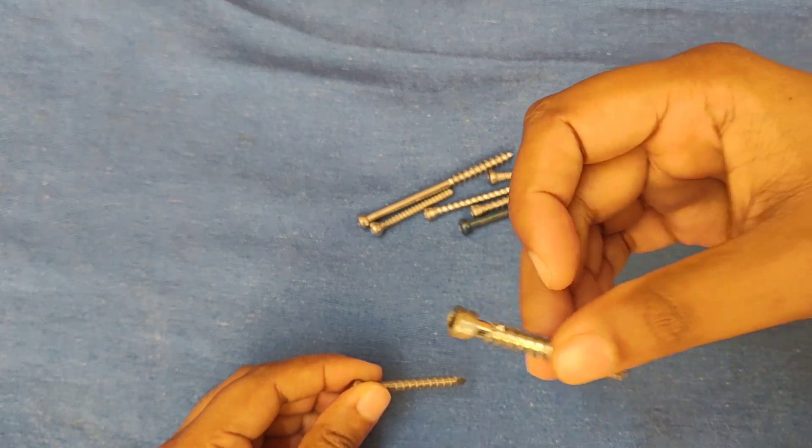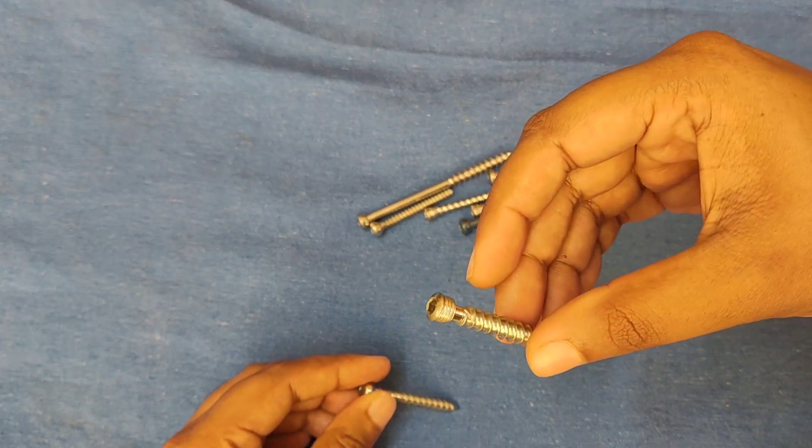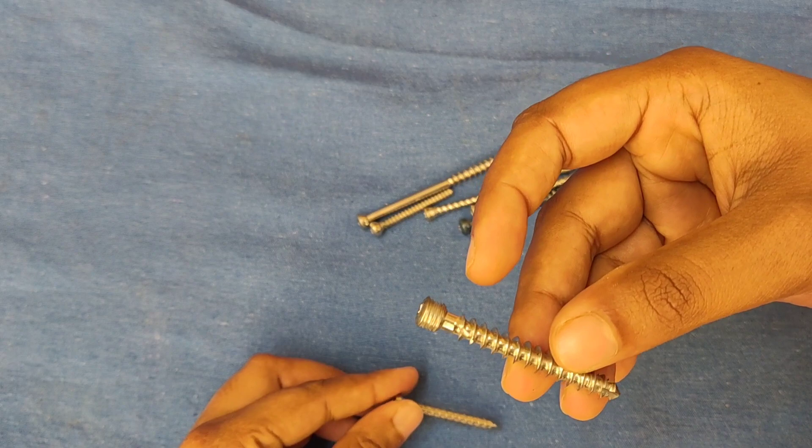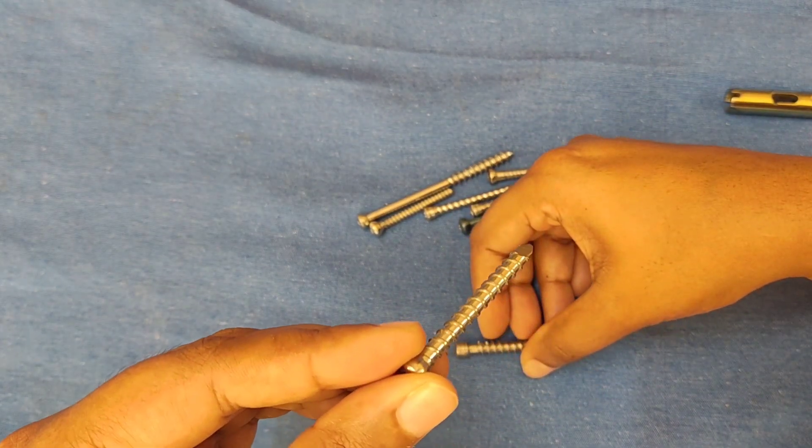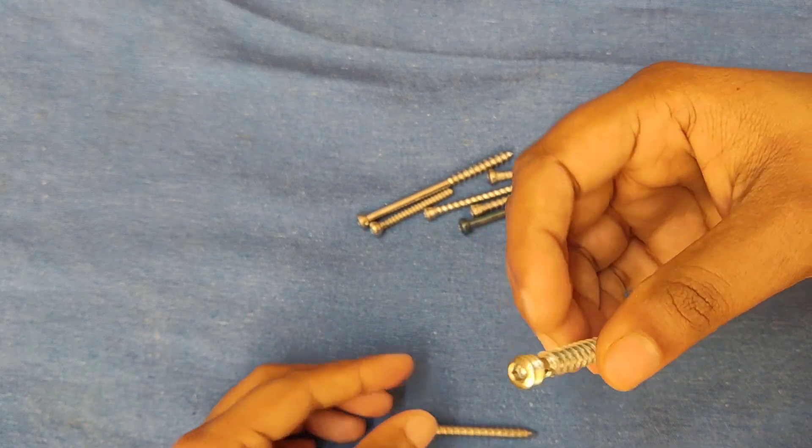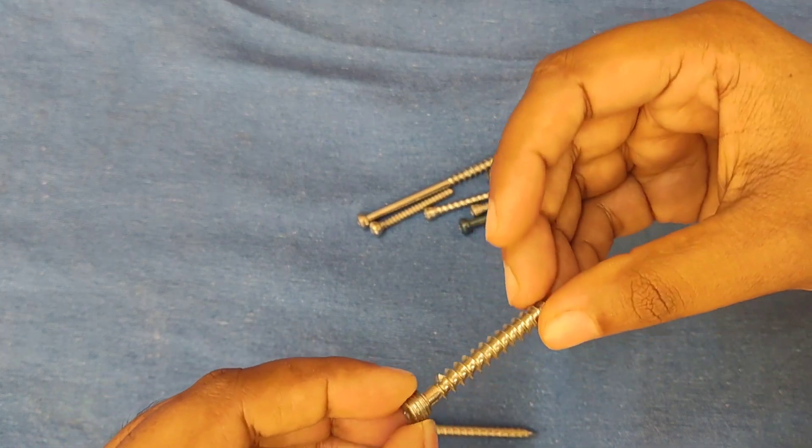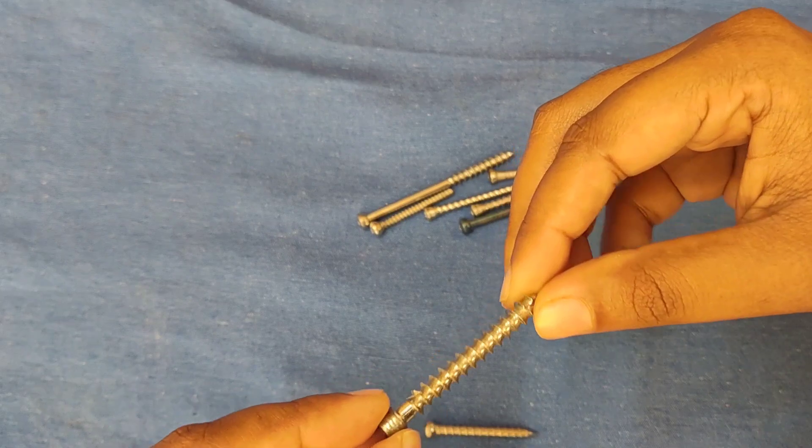This is a locking cancellous screw. Here you can see there are threads present over the head of the screw, and this thread will lock into the plate. This type of screw can be used at the metaphyseal area and also for osteoporotic bone.